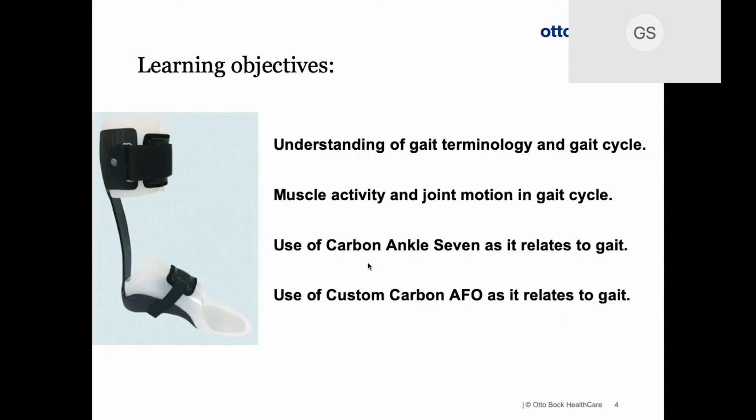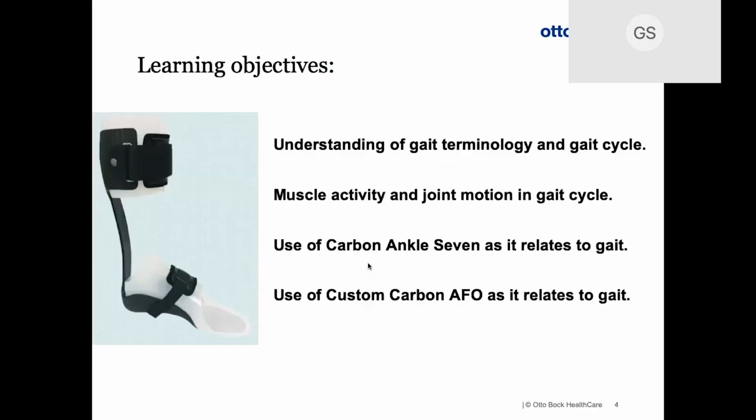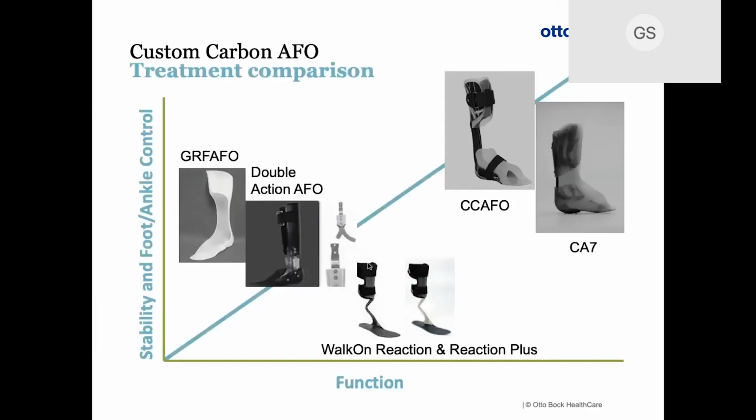And here's another thing about orthotic design. It's changed over the years, right? Originally, orthotic design was really meant to stop the deformity, lock the patient up. So rather than locking and popping like we are with like Rerun from Good Times or Give Me a Break, the thing is we're trying to provide guidance. So it's not about just stopping the gait and limiting it and locking it. It's about guiding that, not just in the sagittal plane, but in the frontal plane and transverse plane.